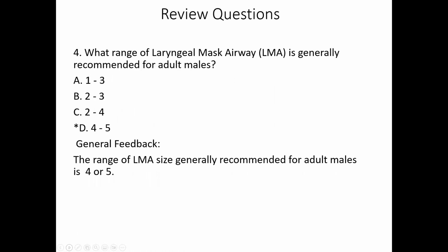What range of laryngeal mask airway is generally recommended for adult males? 4 to 5. Again, small adult, maybe 3, but 4 to 5.